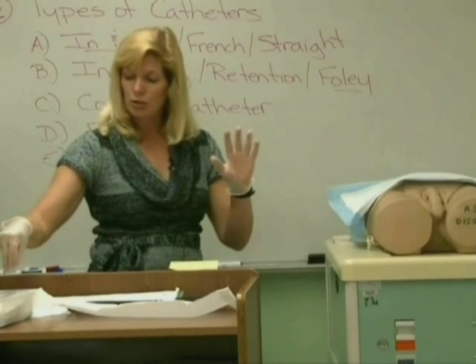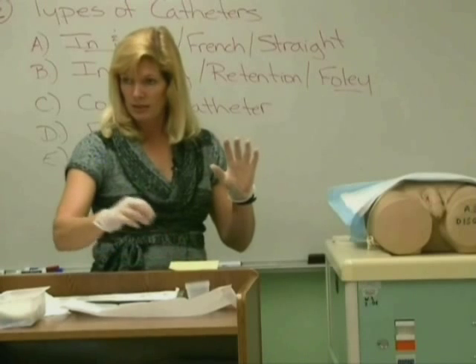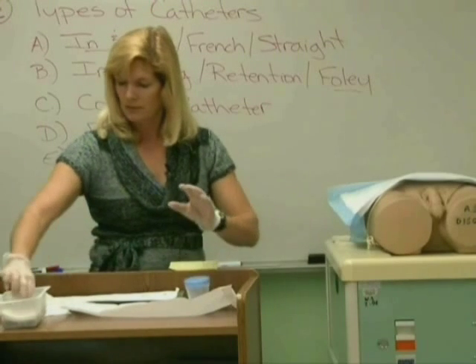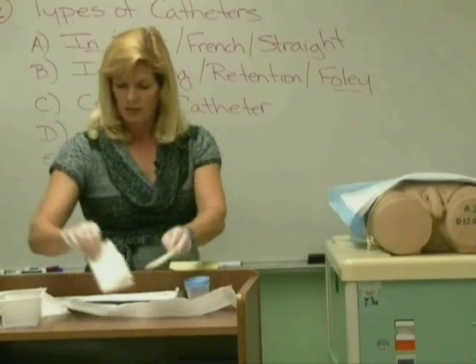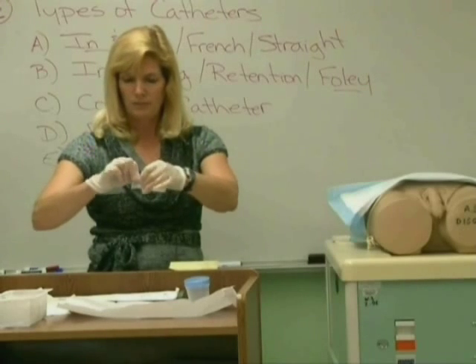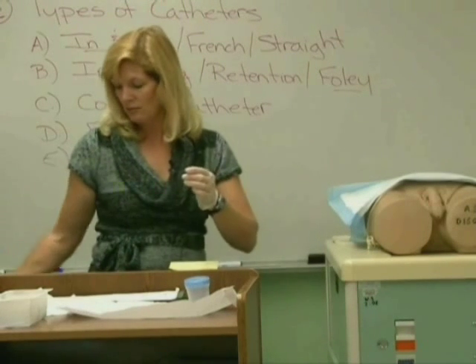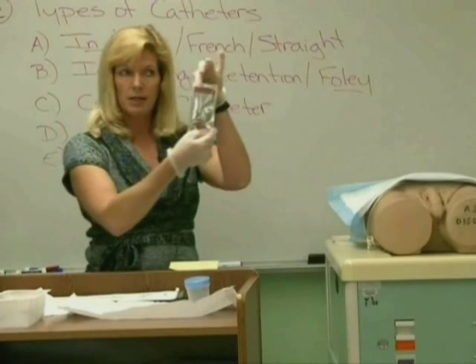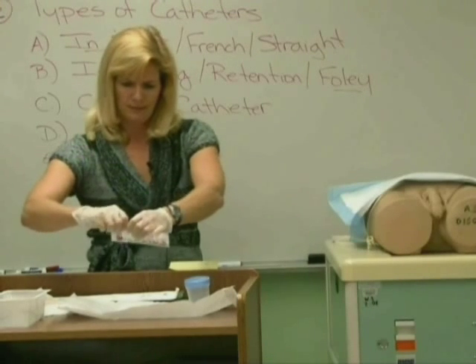Now go into the kit and lay out what you need. Grab the sterile cup, put it down, and unscrew the lid if it has one. You've got two drapes in there. You've got the lubricating jelly — open that up and squirt a little bit onto your sterile field, then throw the rest in the garbage. You've got your iodine swab sticks; they look like Q-tips and they tear down low usually.